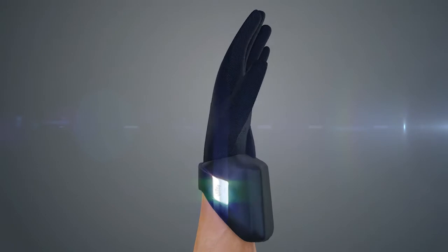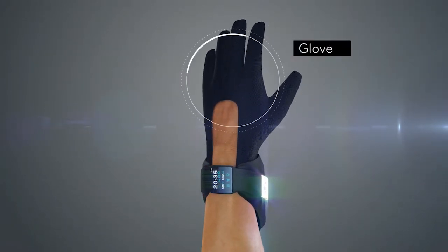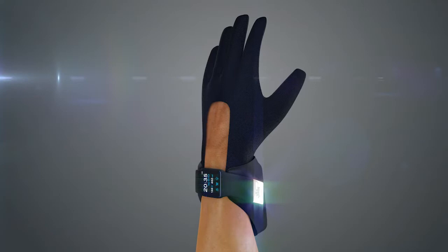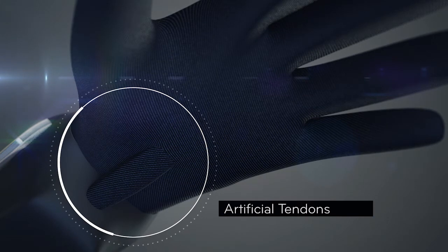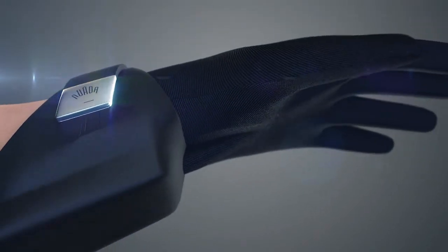The NUADA system was developed to be used every day. It's made of two main parts: a glove that looks like a normal glove, and a bracelet. The glove has artificial tendons inside that mimic the user's own tendons. They adapt seamlessly to all of the user's movements. The artificial tendons connect to the bracelet.